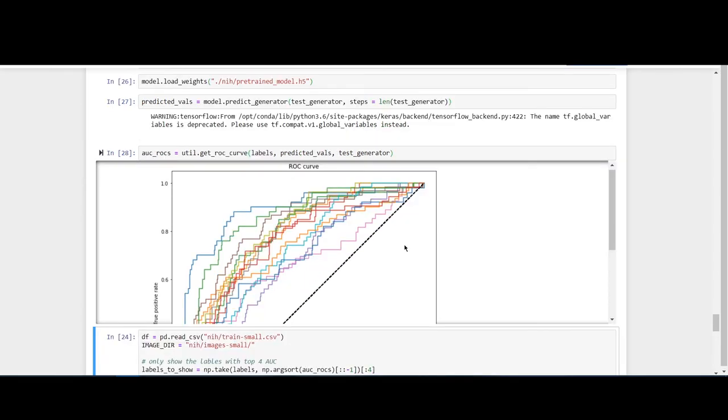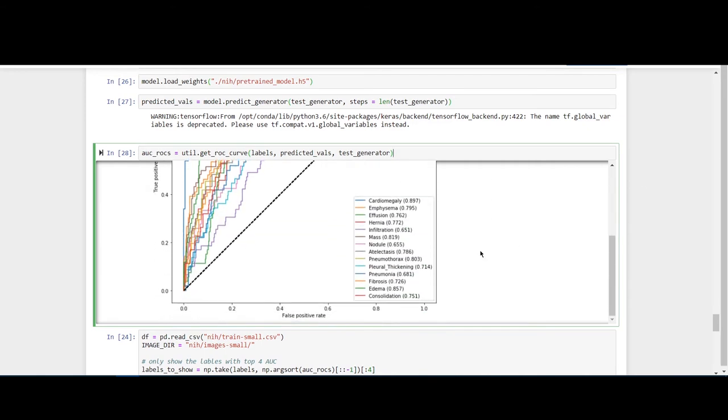You will be wondering what this AUROC curve means. In this we will be using a metric called AUC, area under the curve, from the ROC, receiver operating characteristic curve. This is also referred to as the AUROC value. But how to interpret it? The curve which is more to the left and has more area under it is performing better, which means the model is performing better. You can scroll down here and see the values over here.